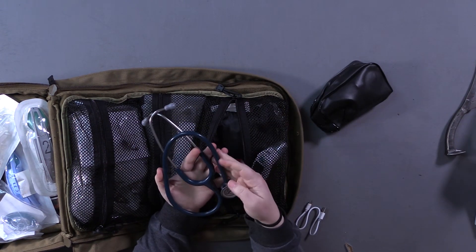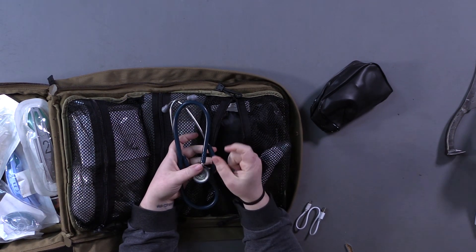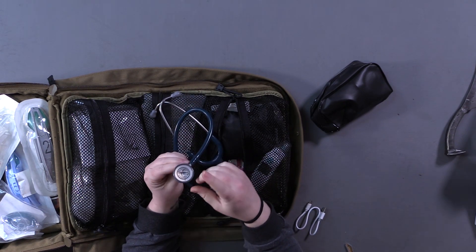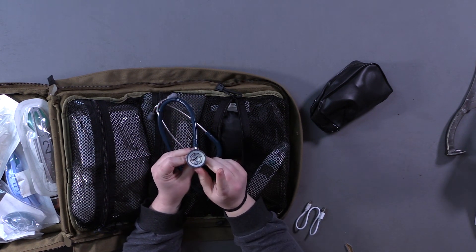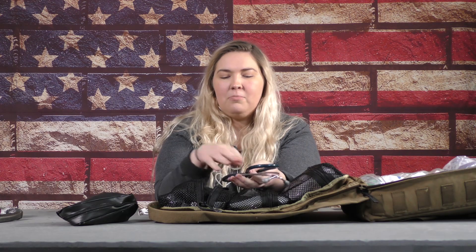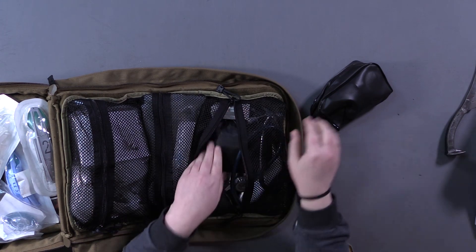We have a Littmann stethoscope — this is actually a pediatric stethoscope. You use the smaller end on pediatric patients. A normal stethoscope has a big side and a little side; on this one it's designed specifically for kids so you can listen to what's going on in their heart better. Littmann is the equivalent of a Glock 19 — they are the best stethoscope makers. You can also get amplified models if you have hearing damage, though they're a lot more expensive.